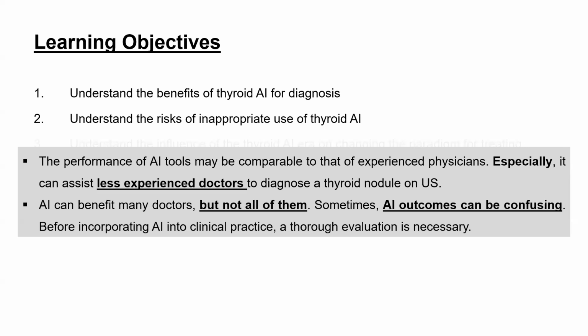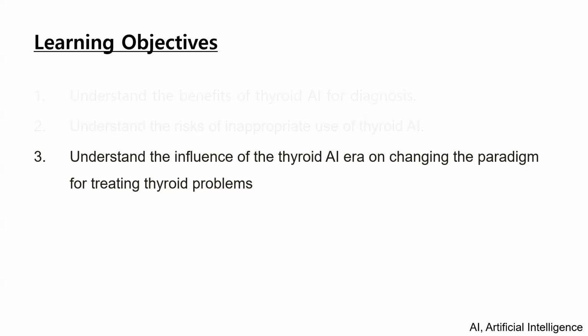In summary, the performance of AI tools may be comparable to that of experienced physicians. Especially, it can assist less experienced doctors to diagnose a thyroid nodule on ultrasound. AI can benefit many doctors, but not all of them. Sometimes, AI outcomes can be confusing. Before incorporating AI into clinical practice, a thorough evaluation is necessary. Let's move on to the final learning objective.